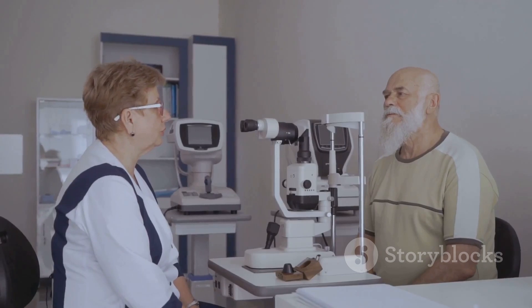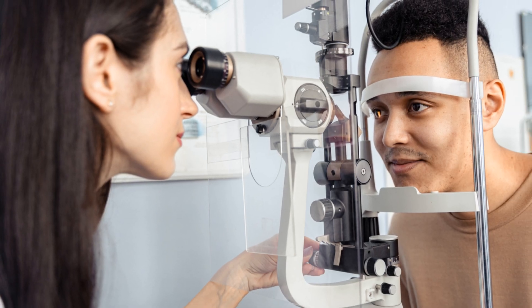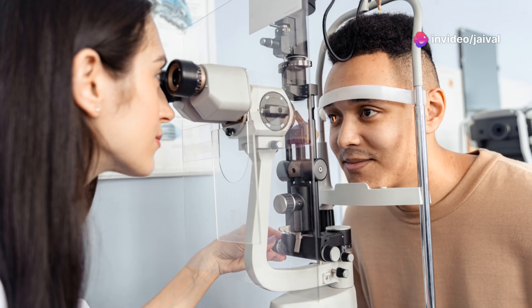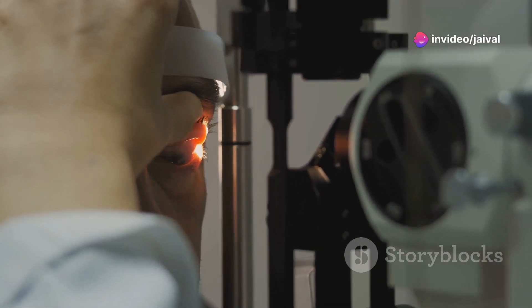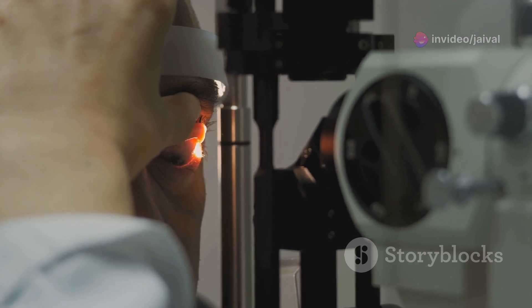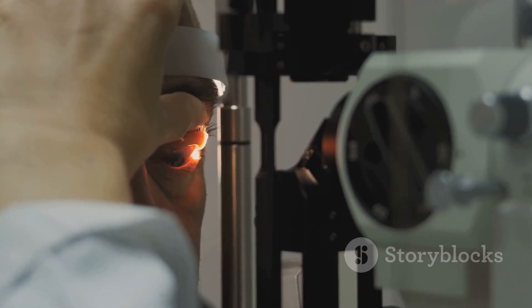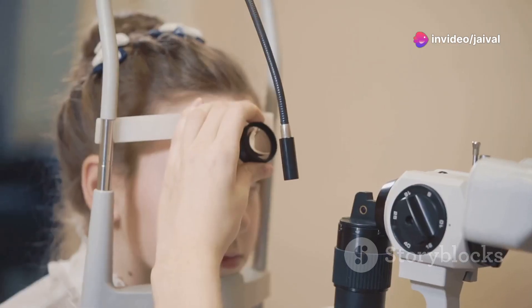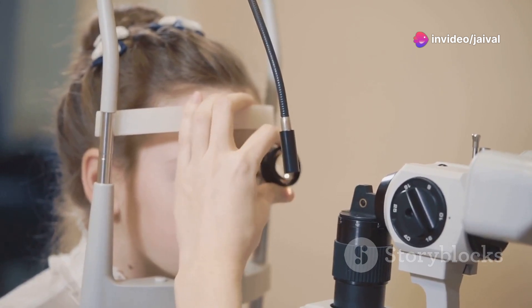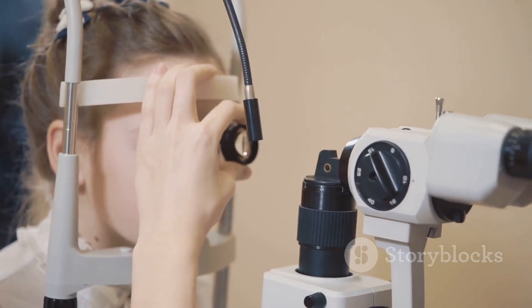Glaucoma damages the optic nerve, which is responsible for transmitting visual information from the eye to the brain. Damage to this nerve can result in irreversible vision loss if not detected and treated early. Gonioscopy helps diagnose and manage glaucoma by assessing the angle's structure and function. By examining the angle, clinicians can determine the type of glaucoma and the best course of treatment. Early detection through gonioscopy is critical for timely treatment and preserving vision. Identifying issues at an early stage allows for interventions that can prevent further damage and maintain quality of life.